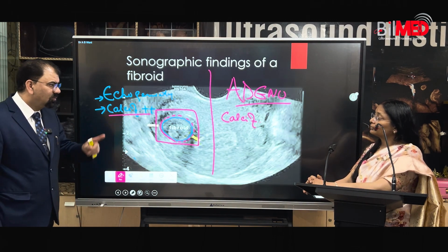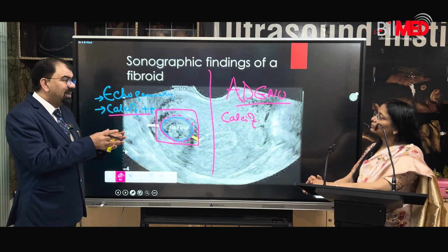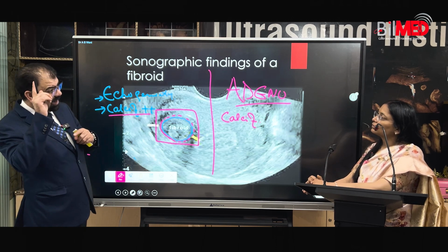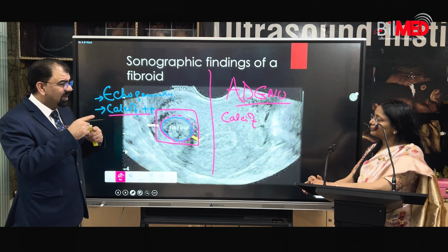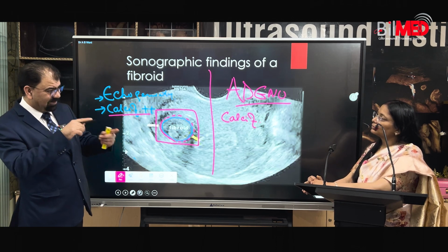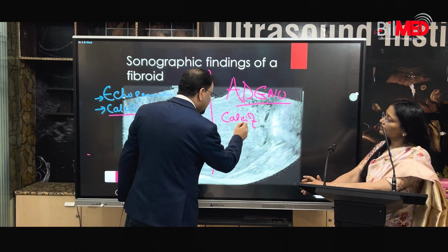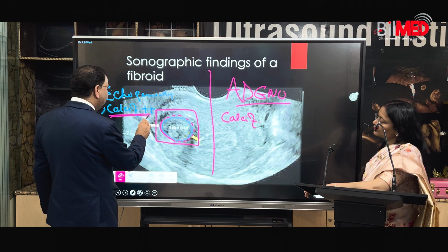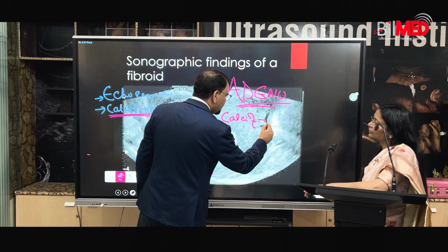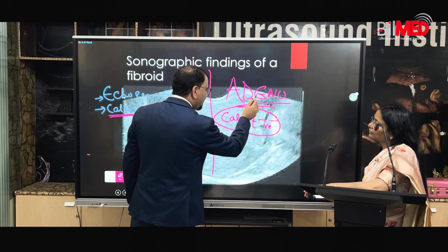No. Why? Because this adenomyotic patch is actually endometrium, ectopically implanted, which is connected hormonally. So this is a live tissue over there, which is connected. This is important. Which is connected hormonally. So calcifications, if seen, are going in favor of fibroid, and if there are no calcifications, that is going in favor of adenomyosis.